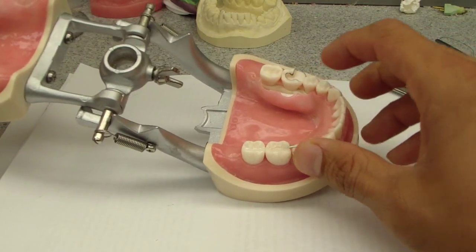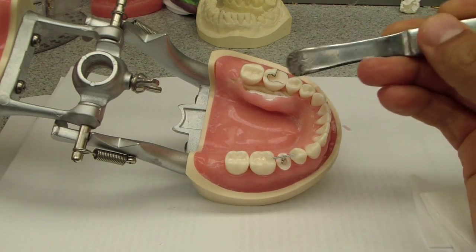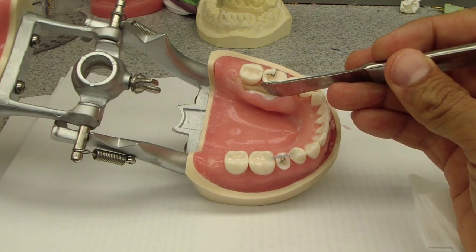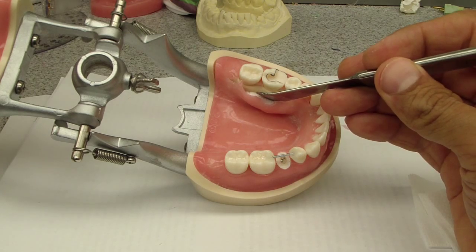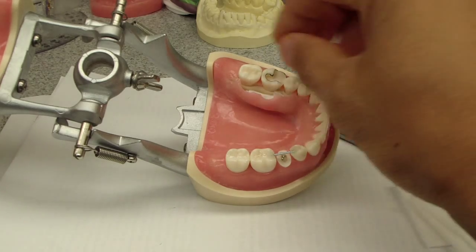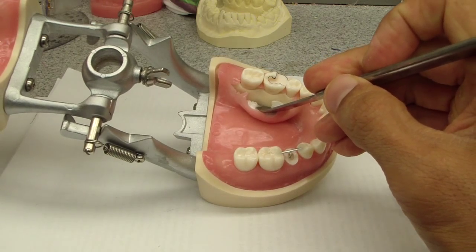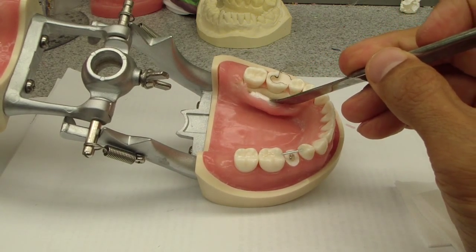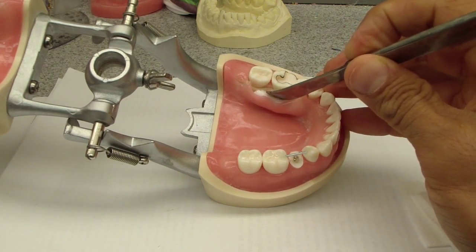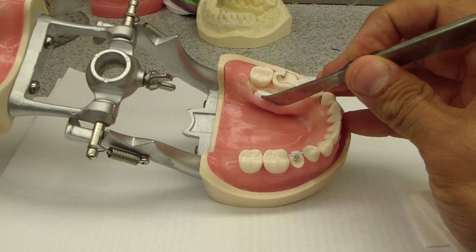In addition, my perio mentor was discussing that when he's placing implants or even completing crown lengthening on the mandibular arch, he'll elevate the lingual mucosa and periosteum as well, to make sure — and we were talking about ensuring not perforating the lingual plate. So in an effort to keep the tissue away and maintain hemostasis, he places a little bit of gauze there.